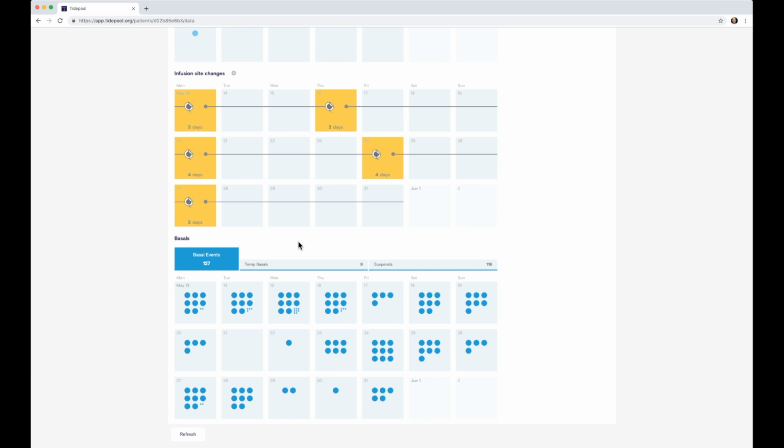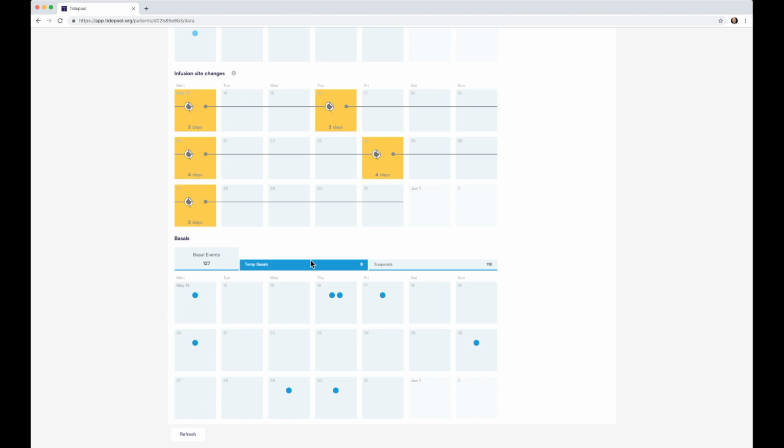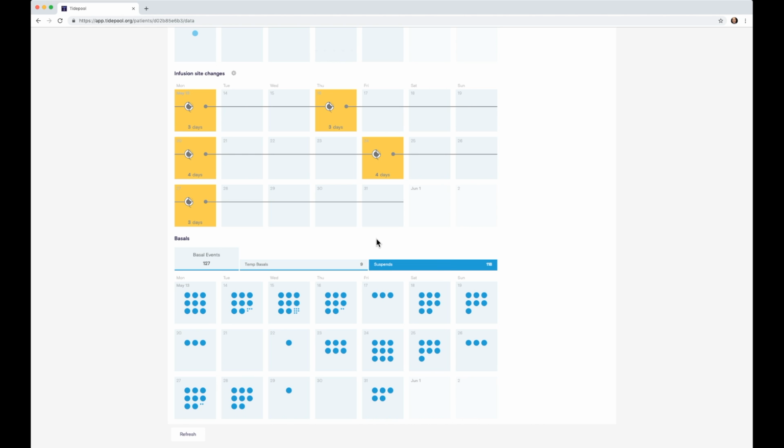At the bottom of the Basics screen, we have our basal section. Here we can filter for temporary basals where your patients are requesting more or less insulin than was previously scheduled within their basal profile. Or in the case of James Jellyfish, who again is using that t:slim X2 with Basal-IQ, you can see how often his basal was suspended.